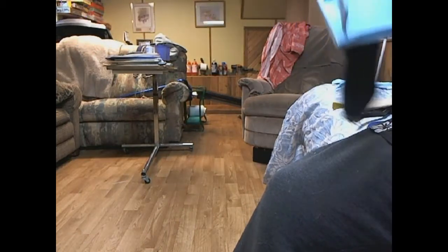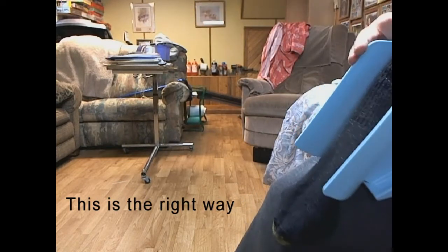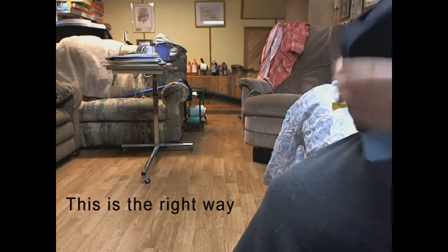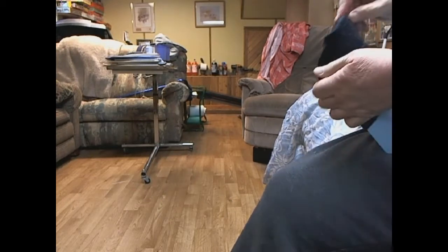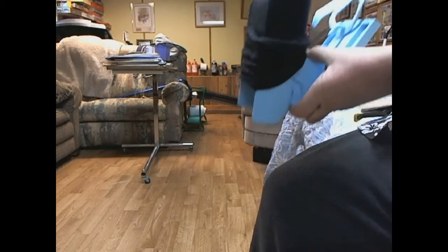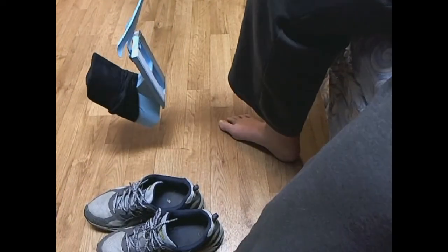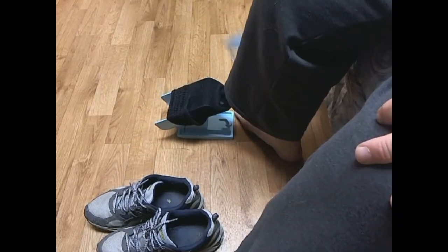well, of course, dummy starts off wrong. Take it like this, and put the sock in, and you basically wind it up like this, and pull it up, pull it up, pull it up, and you're looking to get the heel right here in the middle. Okay, and then you take this thing, which is what it's for, to get it on the ground, and I'll show you. This is so you don't have to bend over. Okay, and it's real useful.